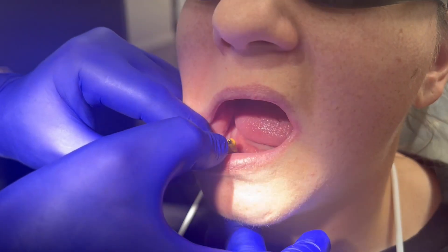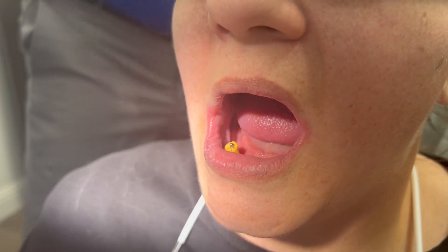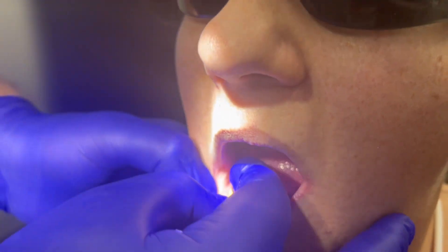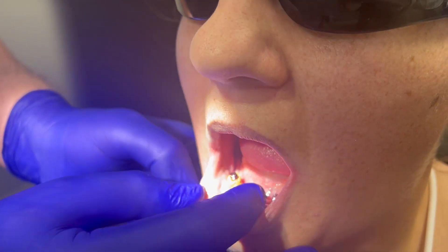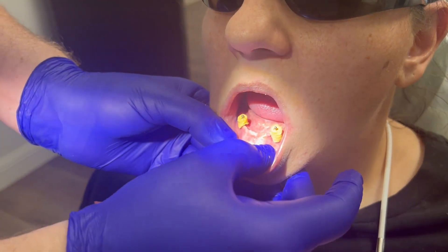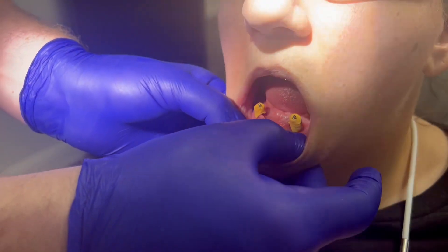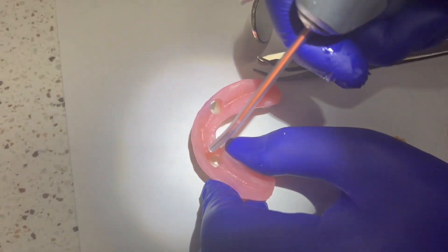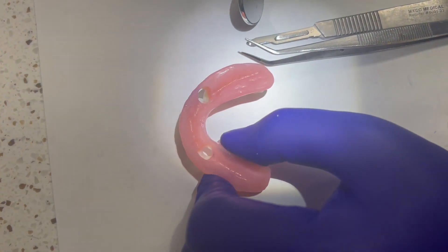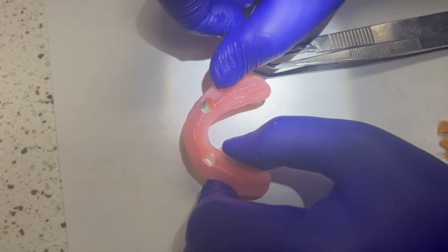You can see that I've modified this so that the housing actually fits over it and there will be no undercut — it's basically a custom block-out. Now I'll work on the other one. I have both custom block-outs created, and then we'll put on the locators. I'm practicing to make sure the denture goes on top of both custom block-outs with the locators on, and I've confirmed it fits.